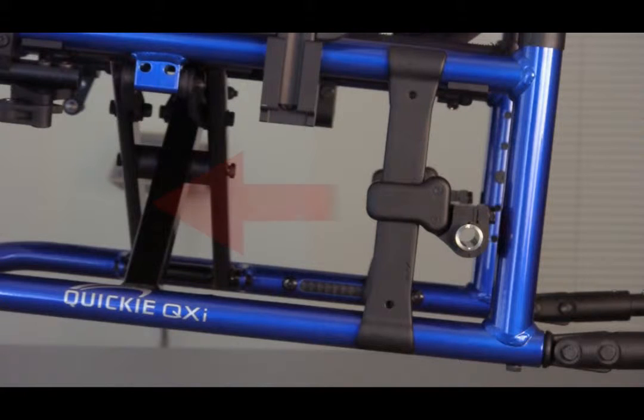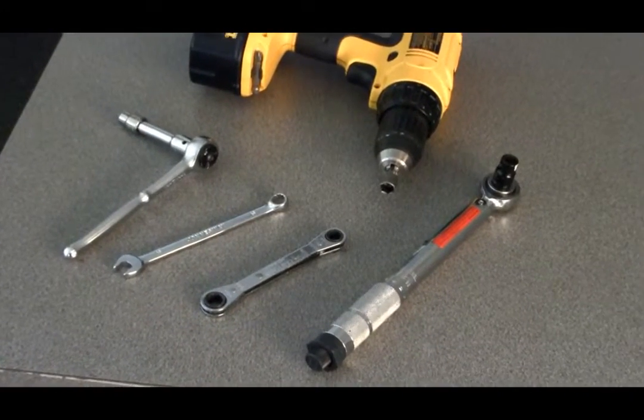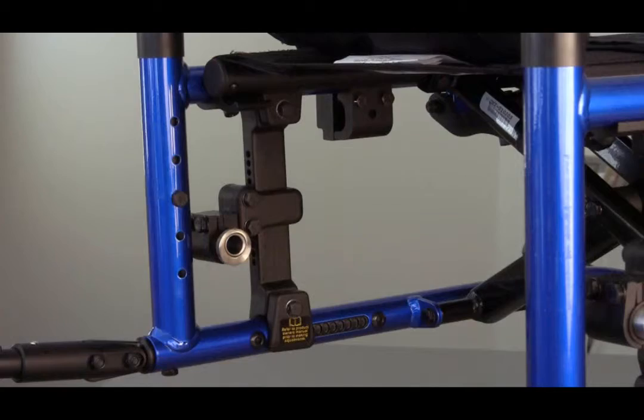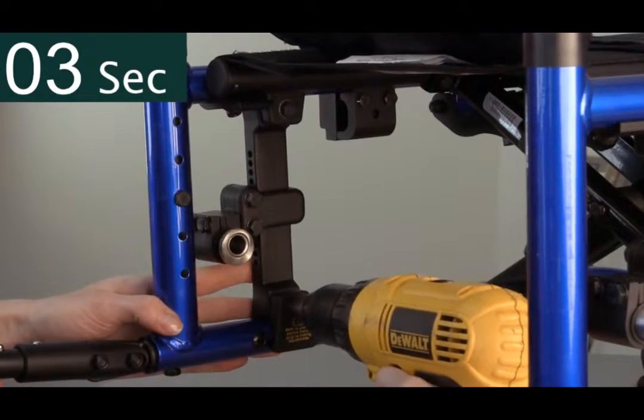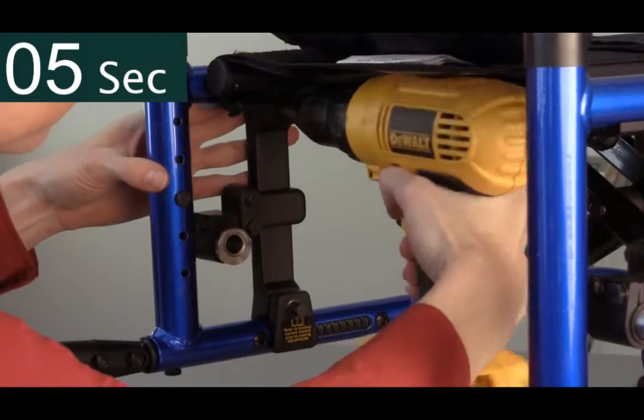If it is determined that the center of gravity needs to move forward once the chair arrives, it is a quick adjustment made with any tool that fits a 10 mm hex head bolt. To make this adjustment, begin by loosening the top and bottom axle plate bolts located on the inside of the chair frame.